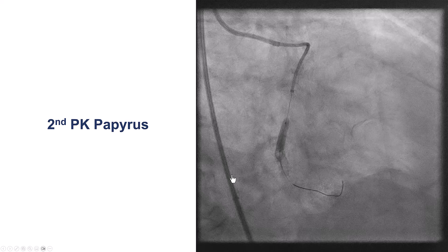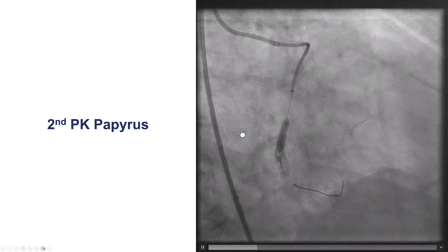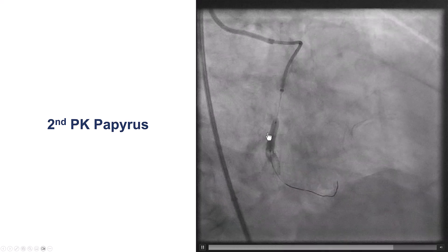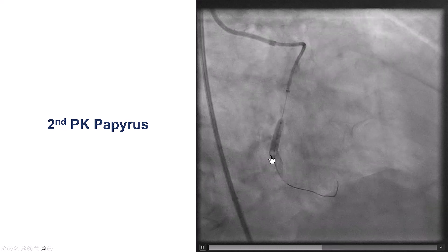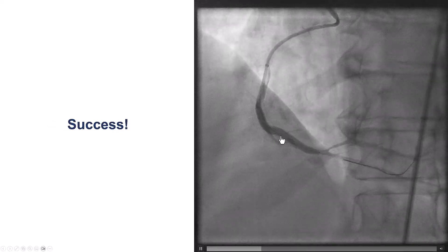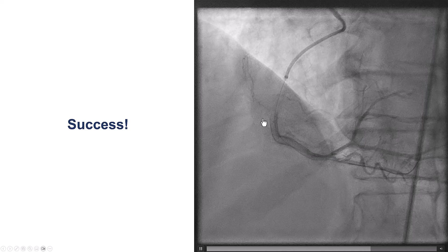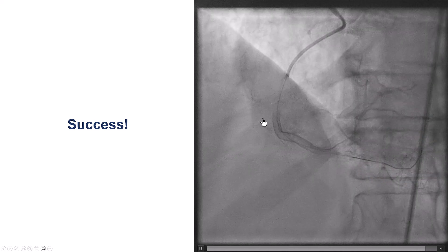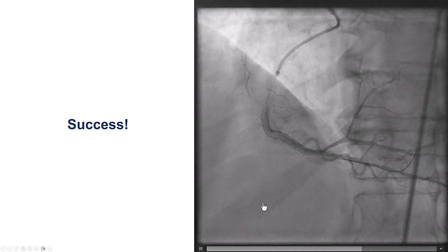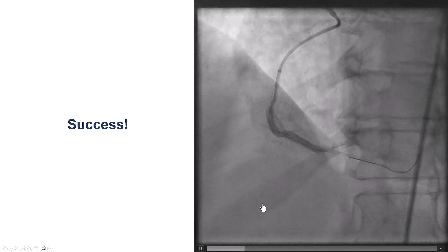What to do next? We decided to place another Papyrus because we thought the mechanism might be that the exit point was different from what we had originally assumed. After we placed another Papyrus more proximally, we achieved complete sealing without any more staining on the wall of the vessel.